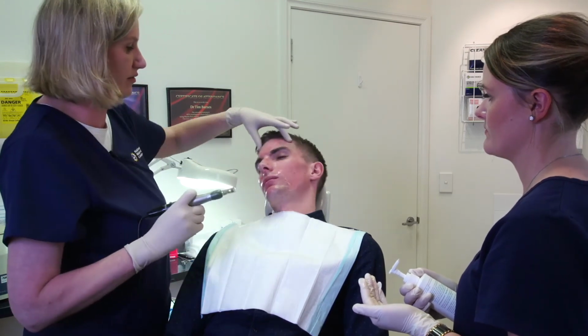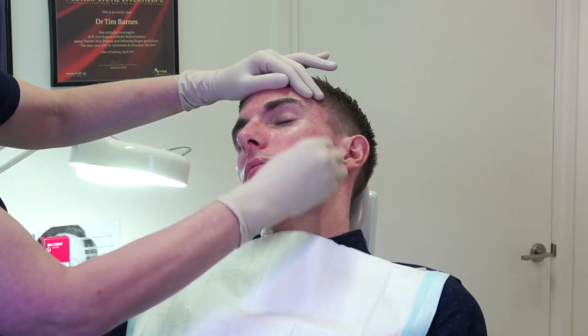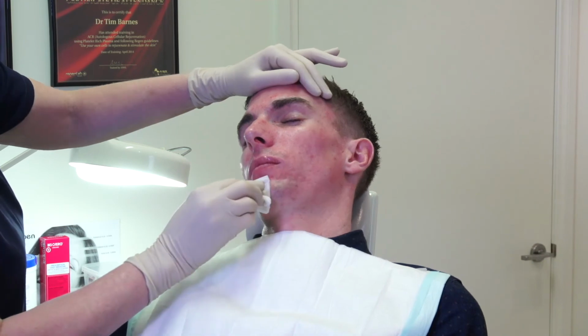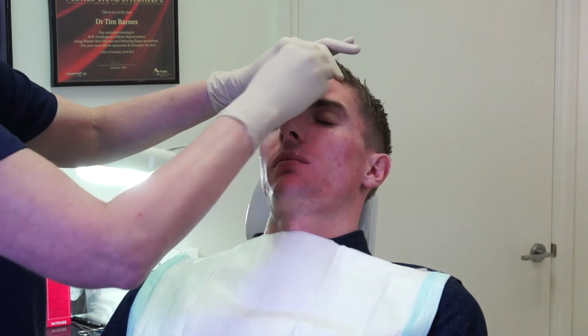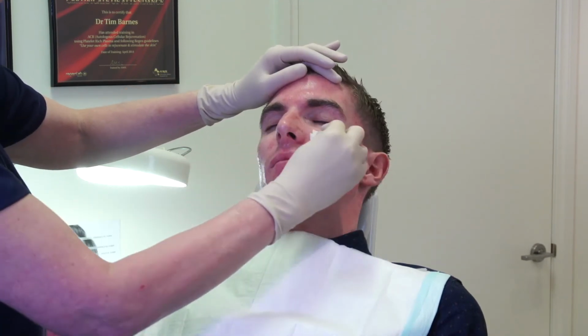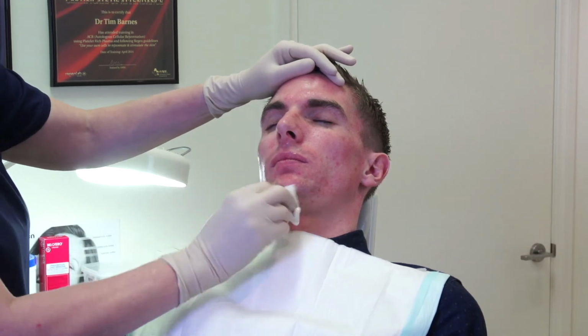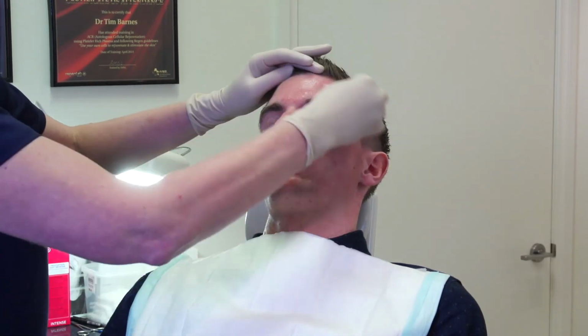Okay, and that should probably suffice, I think. Okay, just wipe it down. Following this treatment, we'll get him to go under the red light, 630 nanometers, to aid that sort of healing process and minimise any sort of bruising or problems he might get from the Dermapen. But most people, after a Dermapen treatment, can go back to work the next day without any major downtime. So you can resume your normal activities after about 24 hours and face the public.